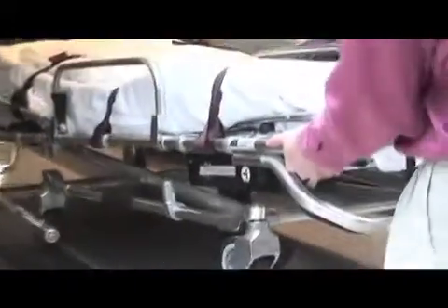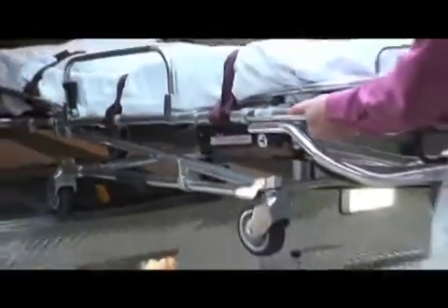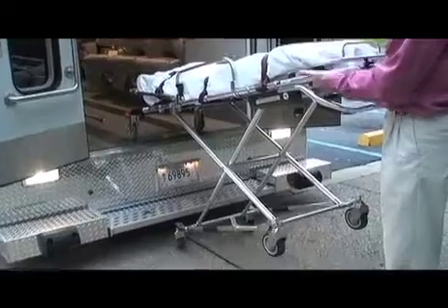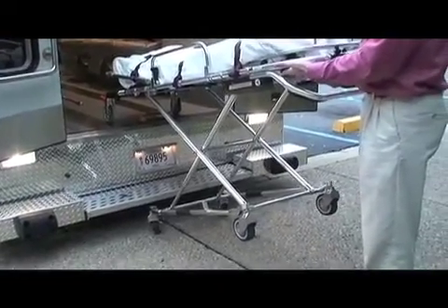When you squeeze that handle, you pull out, and you'll want to have somebody catch the wheels for you, and then the wheels will drop down to the ground. At that point, you release the handle, and the wheels should lock.